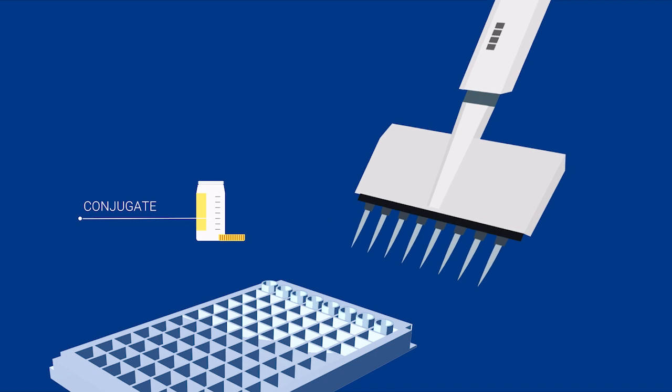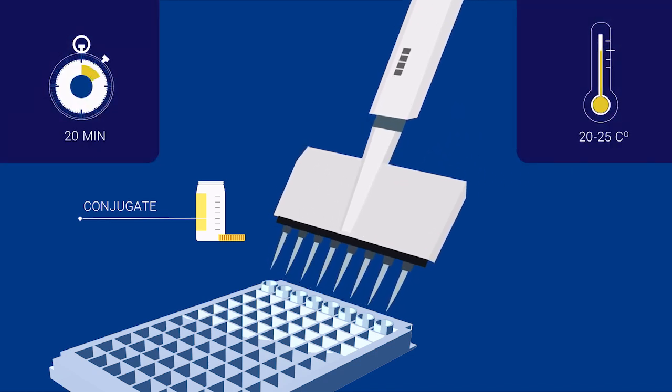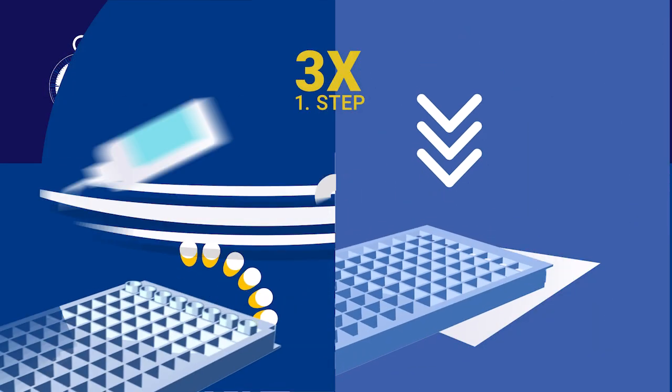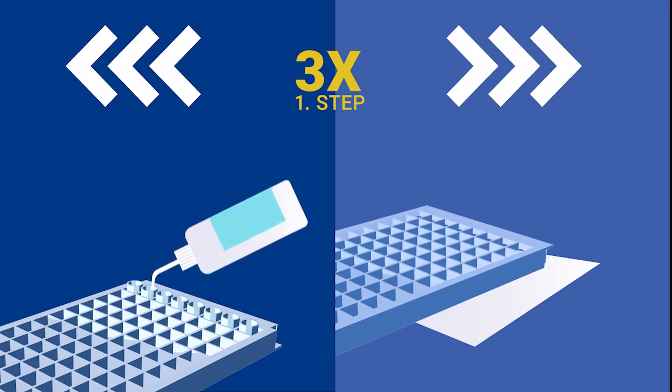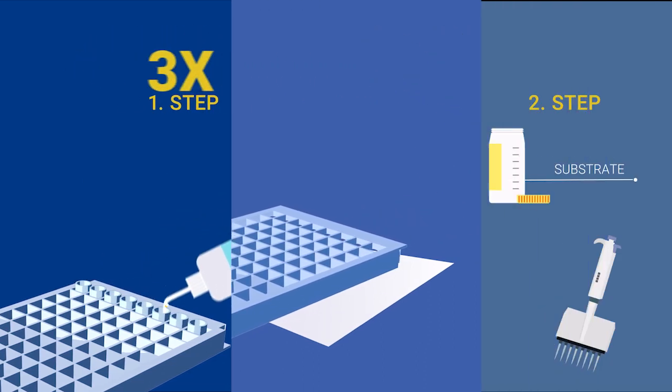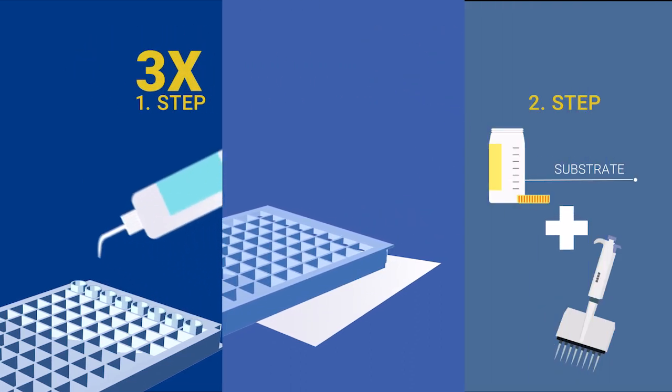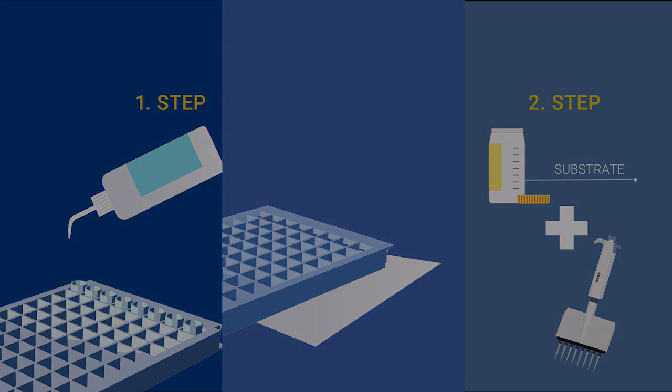Add conjugate solution into the wells and incubate for 20 minutes at room temperature. Repeat the washing step and add the substrate solution into the reaction wells. Put the plate in a dark environment for 20 minutes to allow for color to develop.